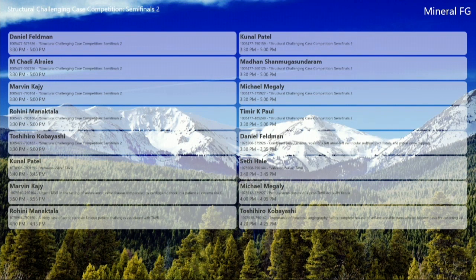Yeah, of course. I'm a colleague from Japan. The etiology of the valve infolding is still unclear. There are not so many case reports. But I guess the valve recapture is a possible cause of the valve folding inside. So I think the main mechanism of the infolding phenomenon is caused by the recapture.